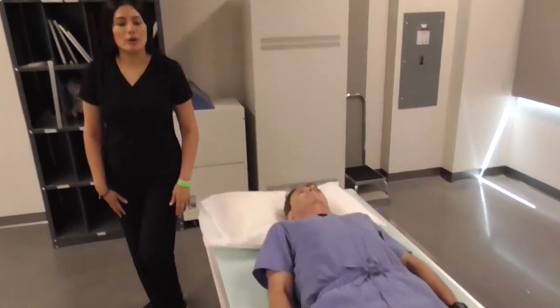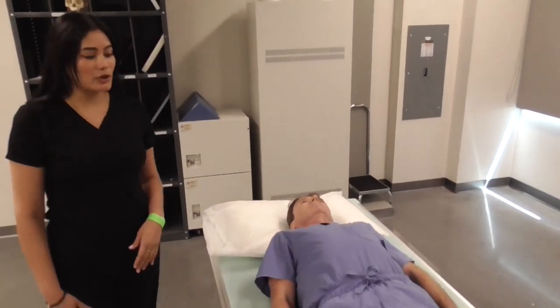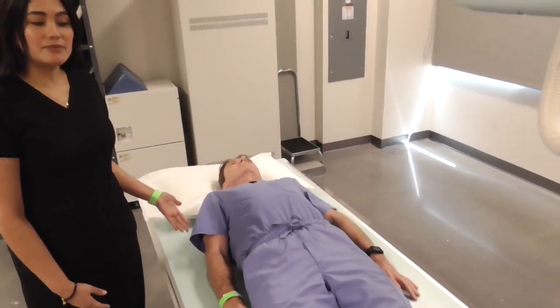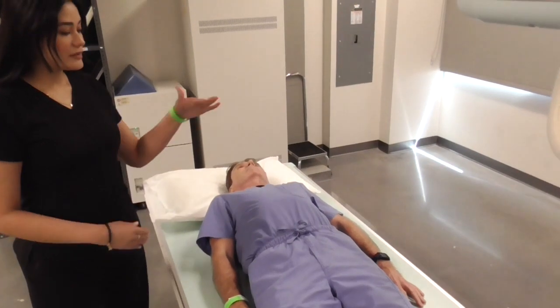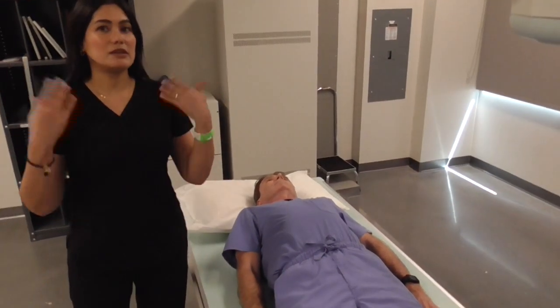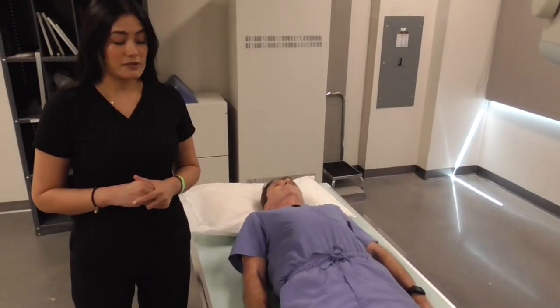And there we go. So this is your supine position. Your patient is AP, facing the ceiling.